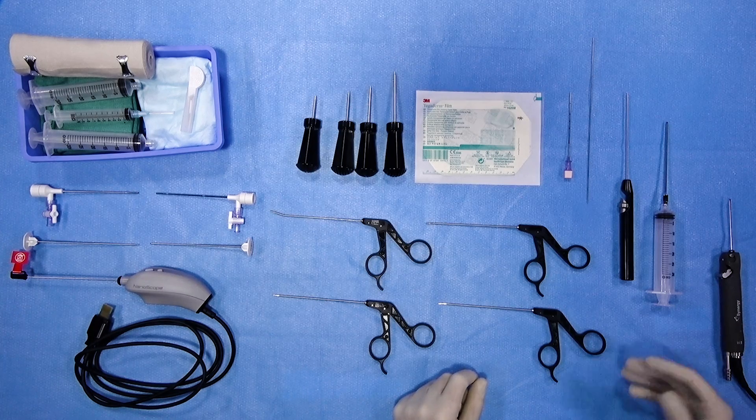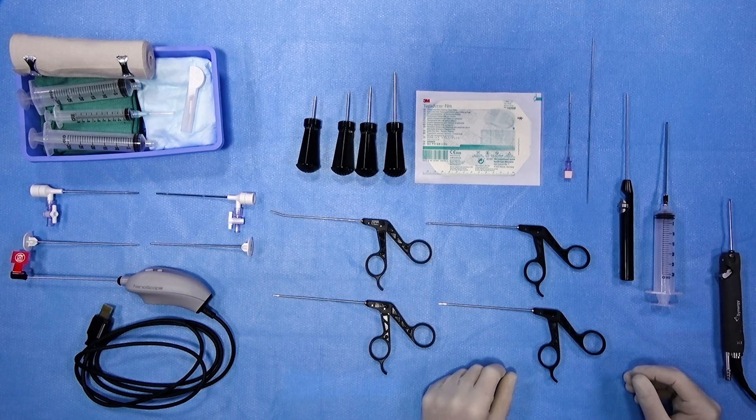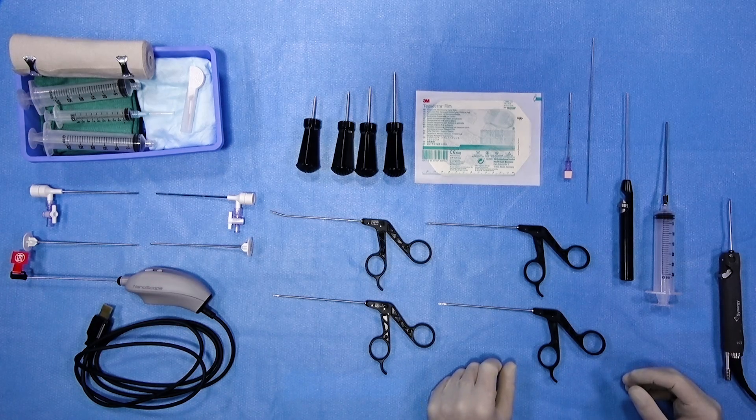Hi, my name is Dr. Matt Daggett. Today I'm going to introduce to you the nanoarthroscopy kit, both the diagnostic and therapeutic aspects. The nanoarthroscopy instrumentation allows us to atraumatically perform these procedures, not just in a procedure room, but in standard OR replacing traditional instrumentation. It provides a much less invasive option for some of these more simple arthroscopic procedures.